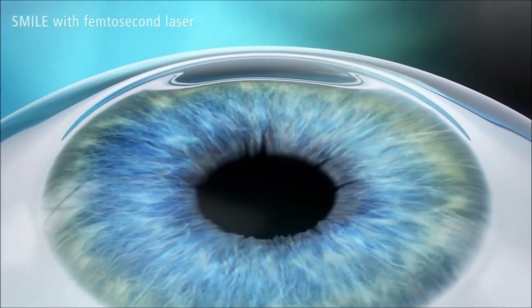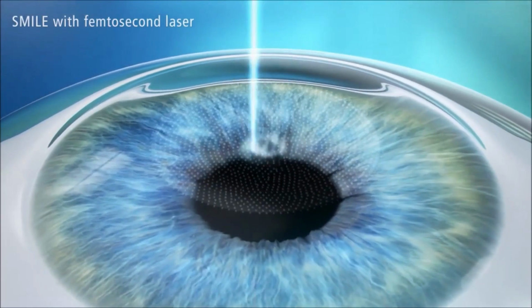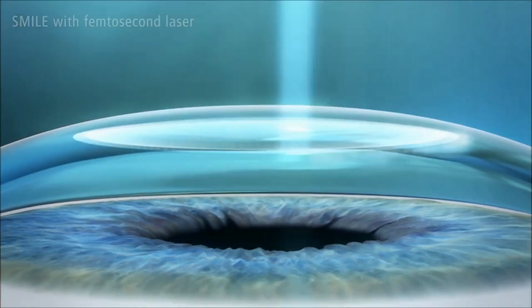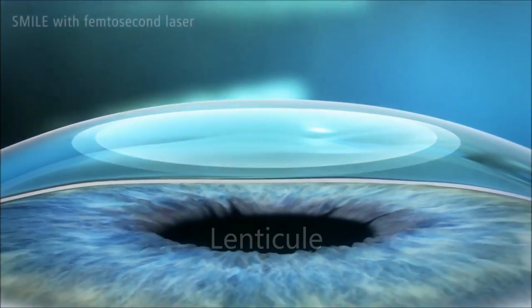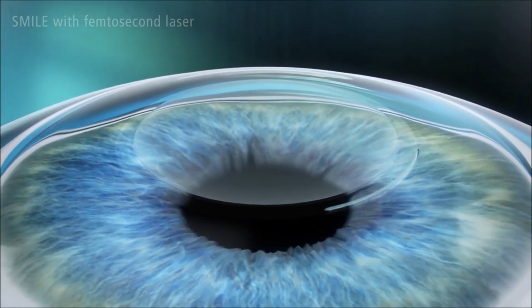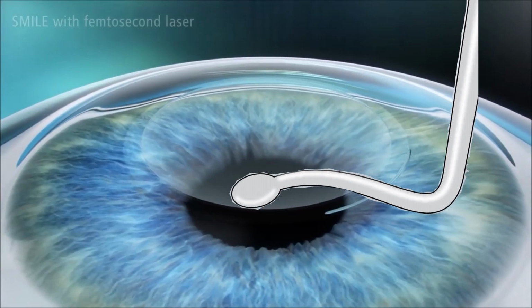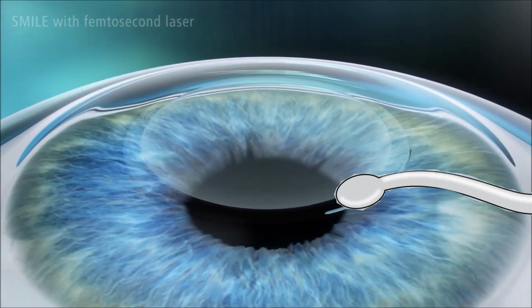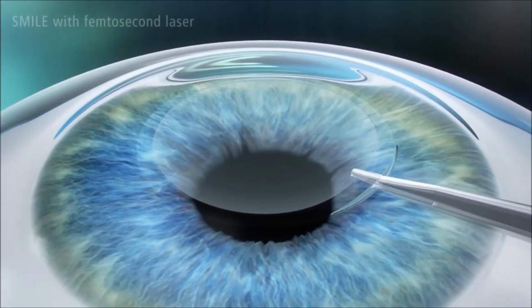For Relax Smile, a small difference is that the femtosecond laser first ablates the stroma through the epithelium, creating a disc-shaped piece of corneal tissue called the lenticule. Next, a small cut is made, so small that the flap cannot be folded back. A lenticule separator has to then be inserted into the flap in order to separate the lenticule from the stroma. The surgeon then removes the lenticule with a pair of tweezers.